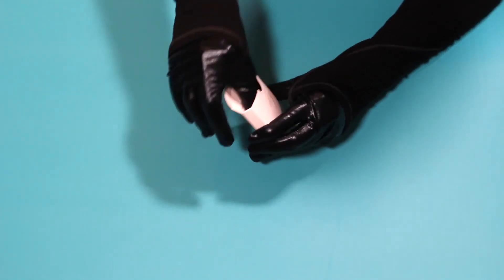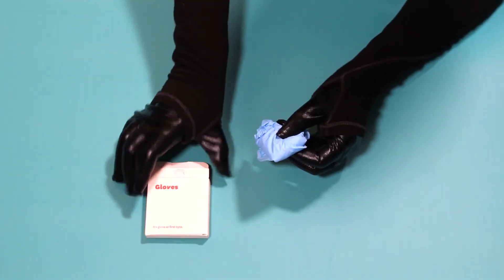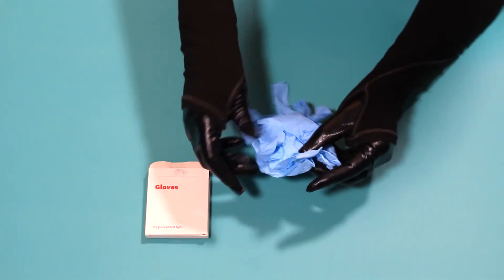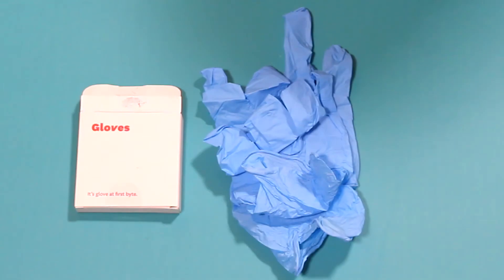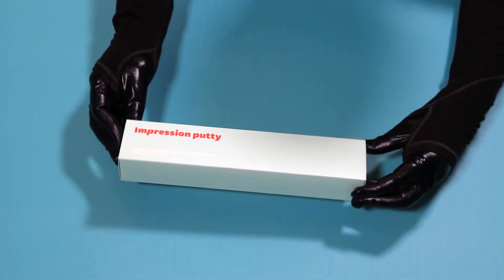These are the gloves for handling the putty and the trays. And this is the putty used for making your teeth impressions.